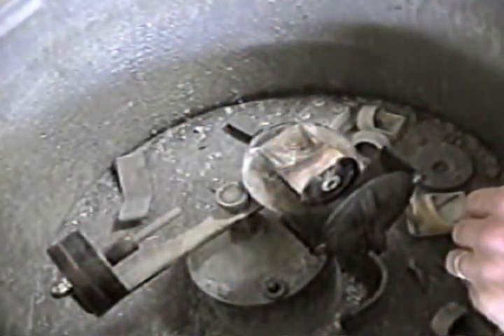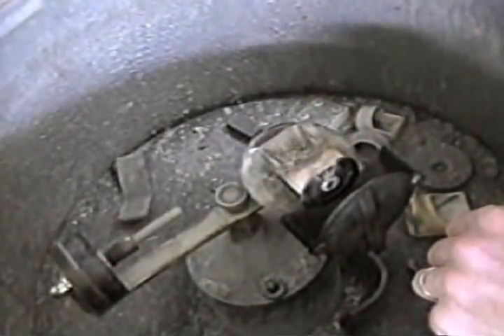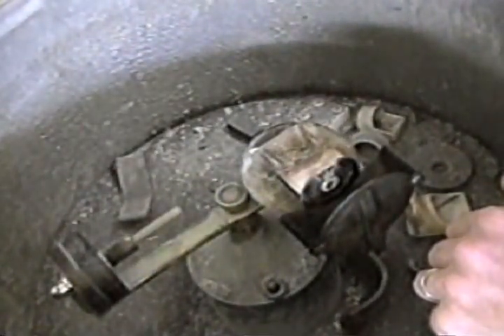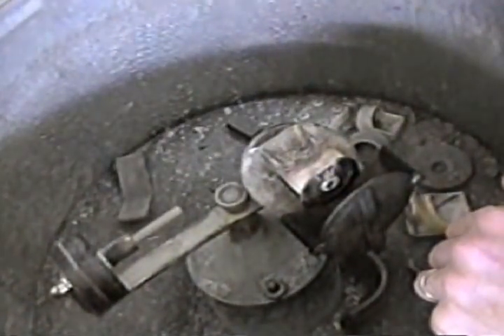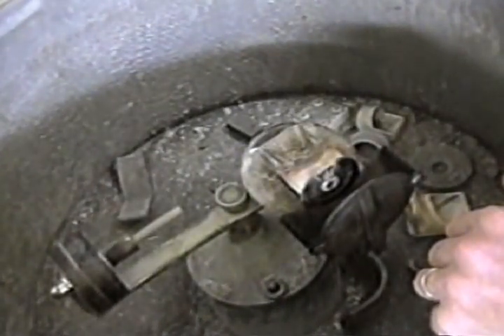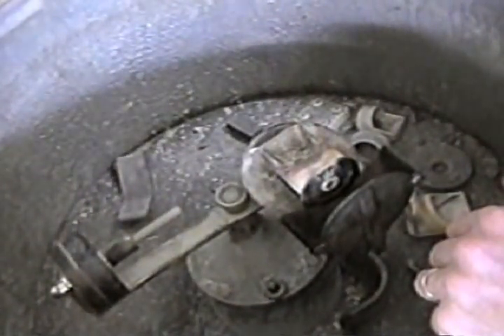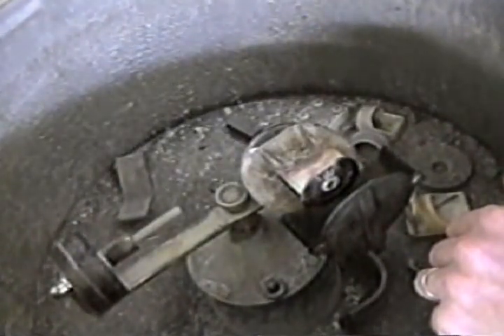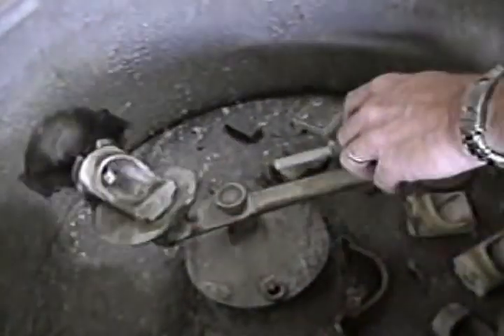Now I'm going to be making a casting. This will be the screw implant gold crown that I'm going to be casting. I'm going to be using Crown and Bridge yellow gold, and my ring has been burning out now for about 20 minutes. I've turned the temperature back from 1600 degrees for the burnout. I turned it to 1300 degrees, and that's where it currently is now, and that's going to be the temperature that I'll make my casting at.